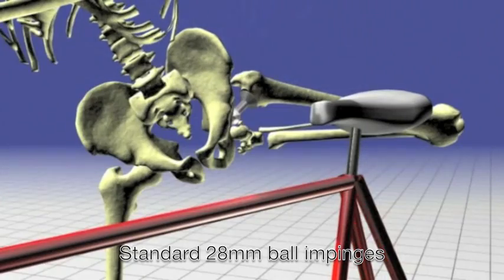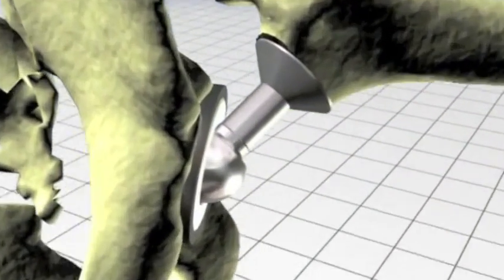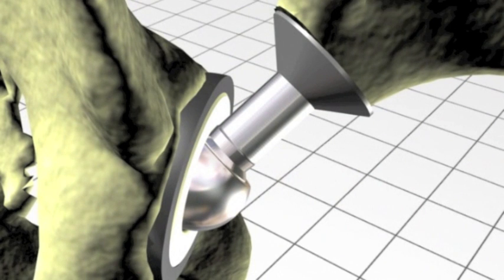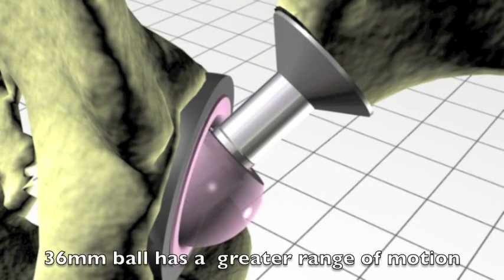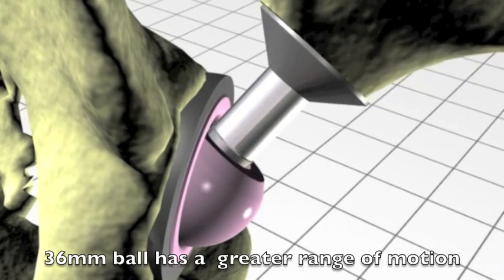In practice, this means that where the smaller 28mm ball would impinge, if we choose a 36mm bearing, we have a greater range of motion.